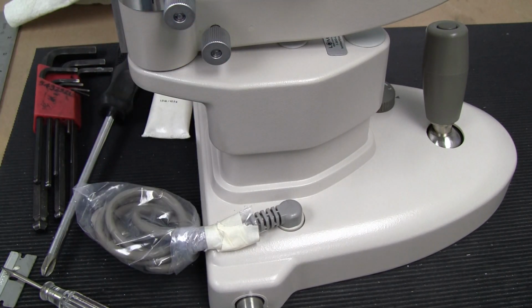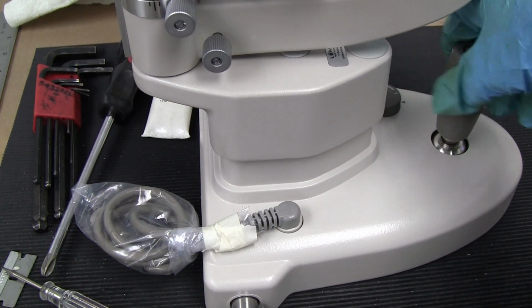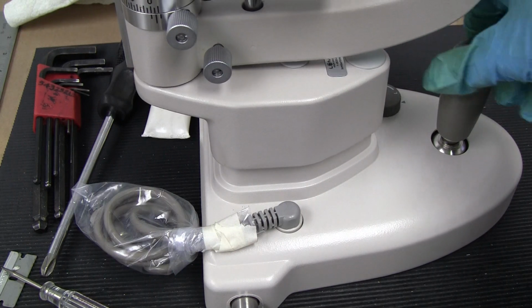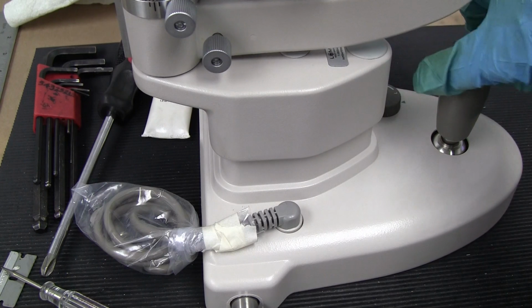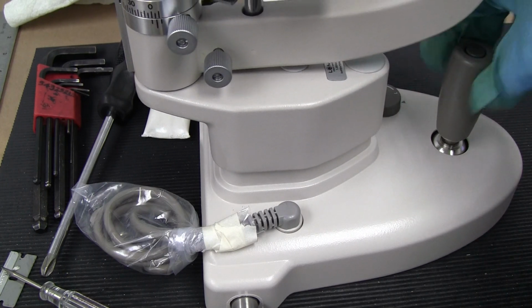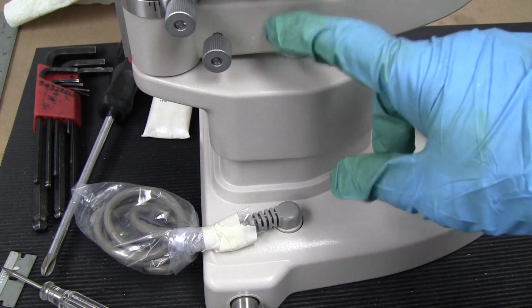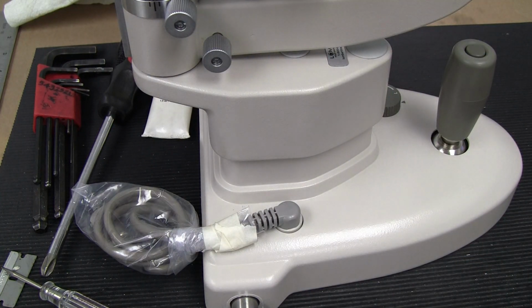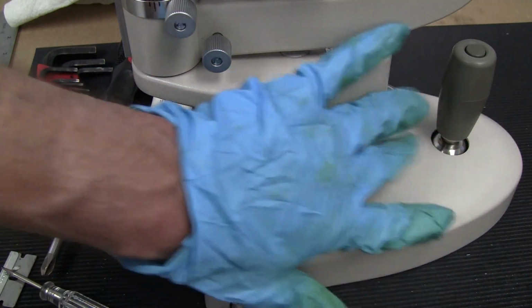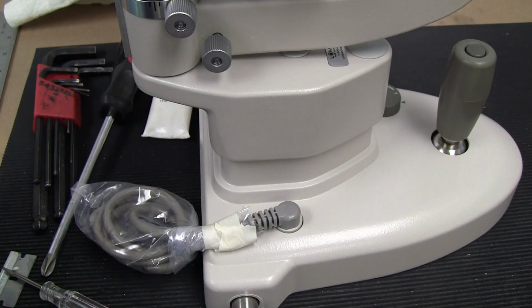issues. But sometimes it doesn't, and the way you can tell is if going down is much easier on your joystick than going up. If going down is easier and going up is harder, then it could be your main spring. So that's what we're going to do today. We've already refurbished everything in here, and now we're just going to tweak it by putting in a new spring.